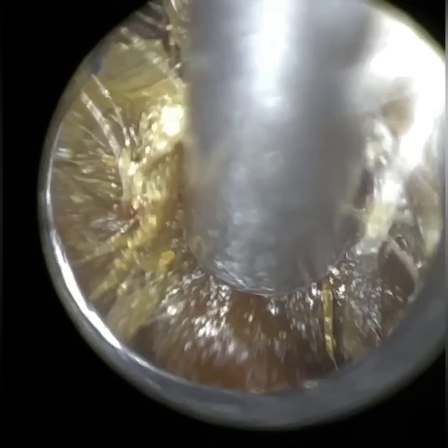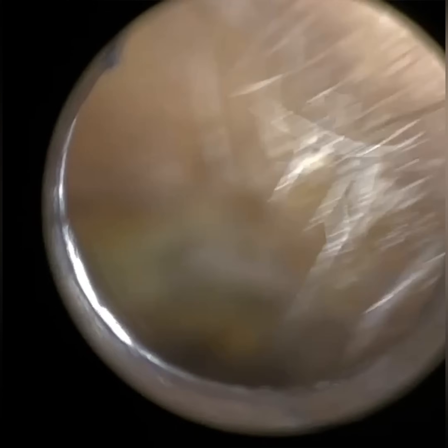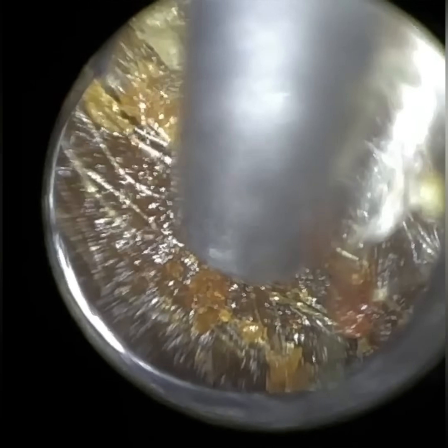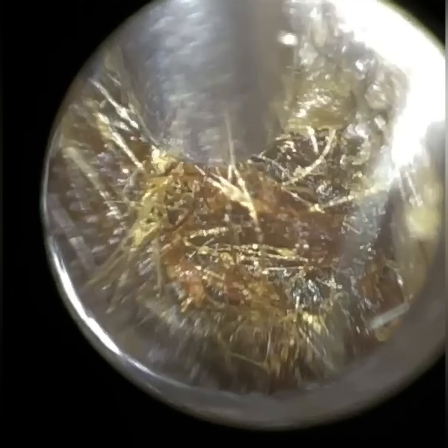There are two ways you can use the Waxscope. You can have the focus set to a fixed level, then either go further in to get more focus on the deeper wax, or come away with the Waxscope if the wax isn't near the entrance. Or — which is what I prefer — fully insert the speculum to straighten and dilate the ear canal, then with my finger on the app I can adjust the focus. We're also working on an autofocus feature where you tap the screen and it focuses on the identified object.